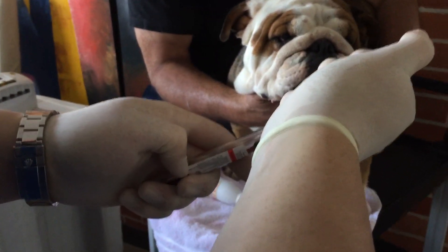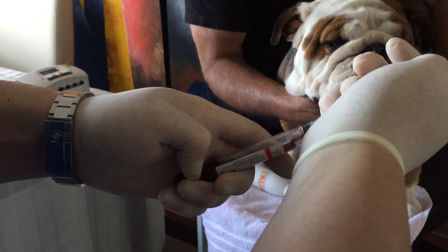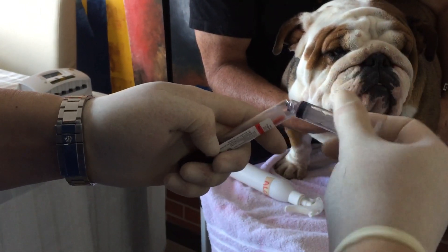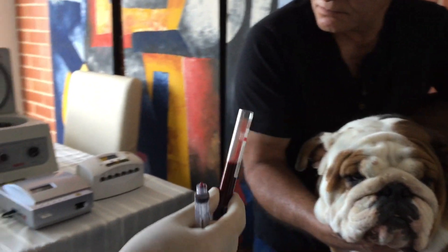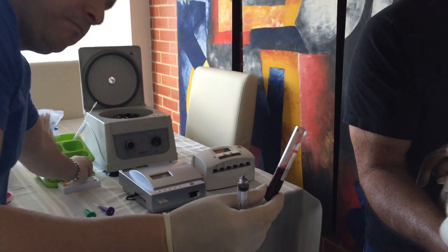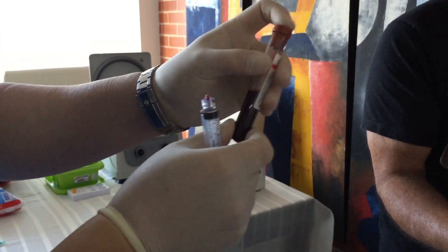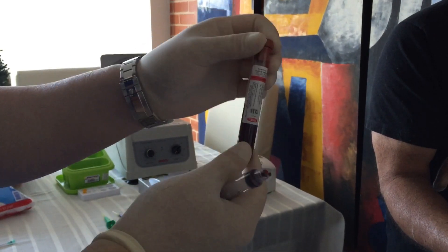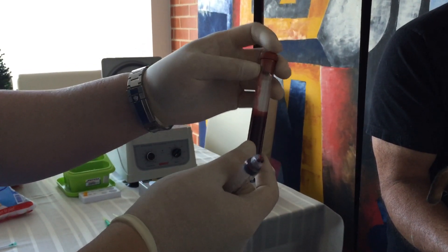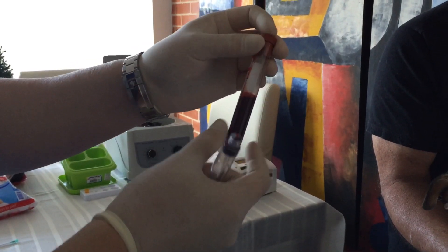Slide the blood really slowly down the side of the test tube. We have five cc's. Let it sit for about 10 to 15 minutes — the more you let it sit, the better serum you're going to get. Wait until it coagulates and then run the test.